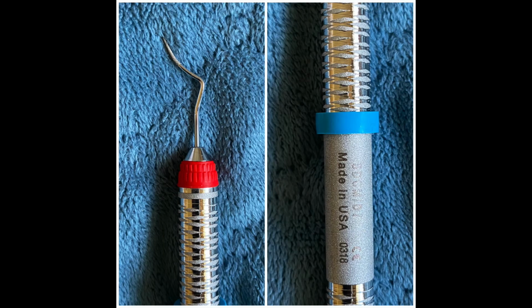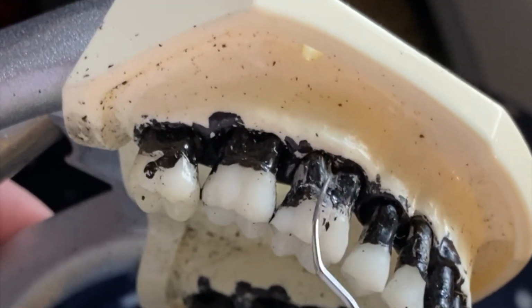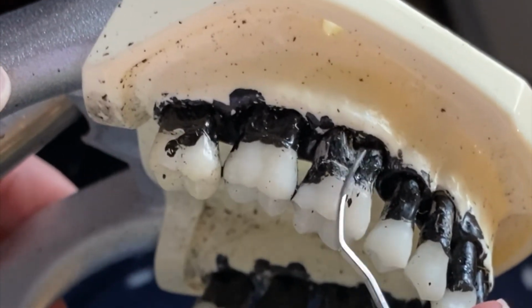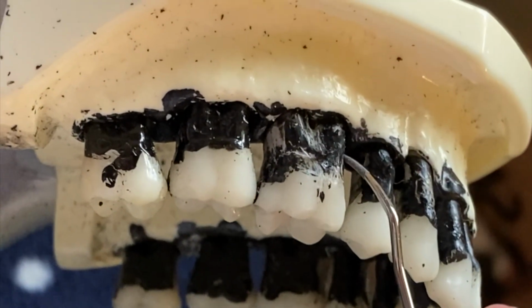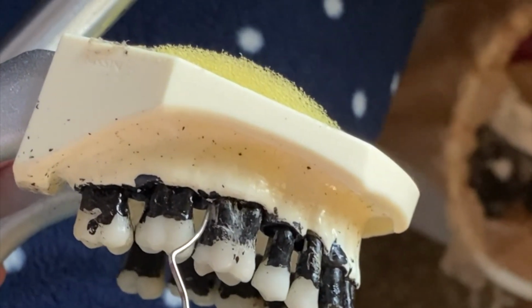The last instrument I'll be demonstrating is the diamond file with a mesial and distal end. This instrument is great for removing light residual fine calculus. As you can see, I'm using that mesial end, and I started from that distal line angle all the way to that mesial end. Now I'll be taking that other end and working on the distal surface.